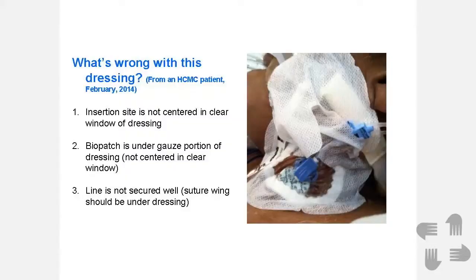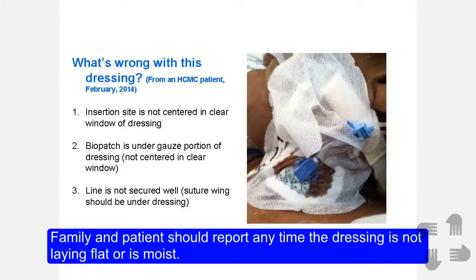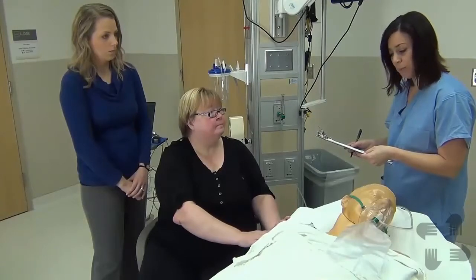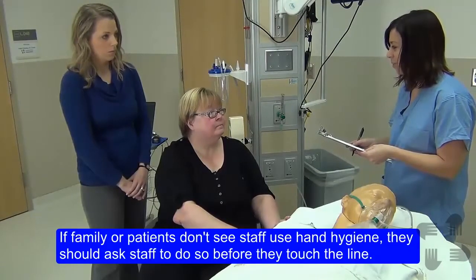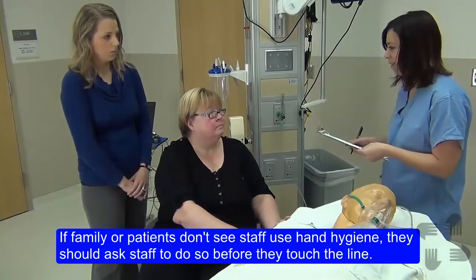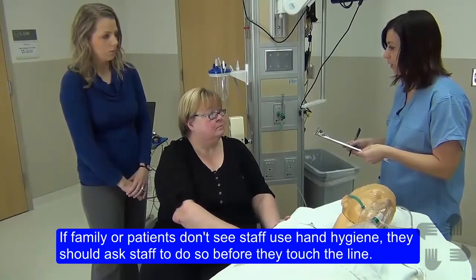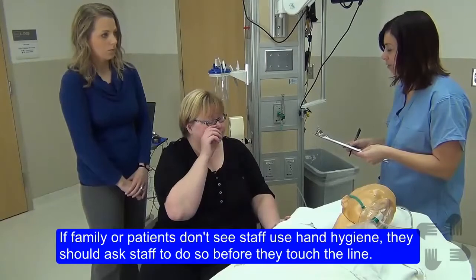The things that you can help with would be that if you see the dressing is looking like it's coming loose after the line is on, let one of the nurses know or let any one of us know so that we can either put a new dressing on or put some tape on to help keep it secure. In addition, we'll definitely want, and you will be seeing us using, hand hygiene, either foaming in with the hand foam that you've been using as you come into the room or washing your hands before taking care of that line, putting medications in.